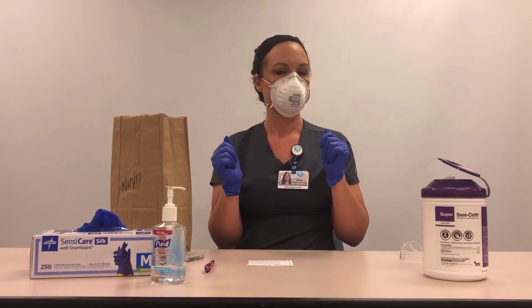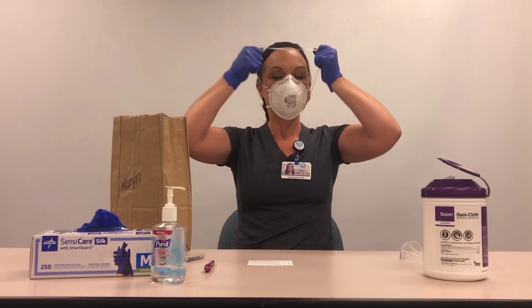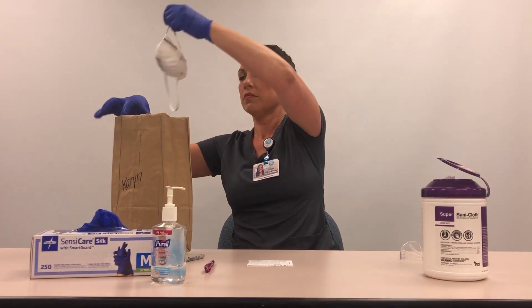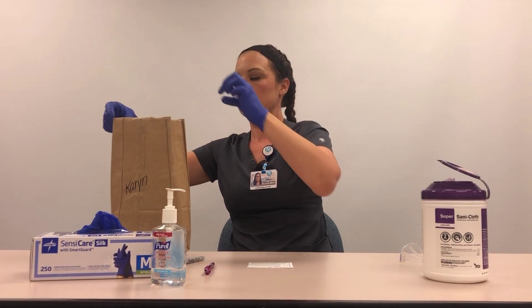Don clean gloves. Remove the respirator by pulling first the bottom strap and then the top strap over your head. Carefully place the respirator inside the clean paper bag. Take care that the shape of the mask is not harmed.